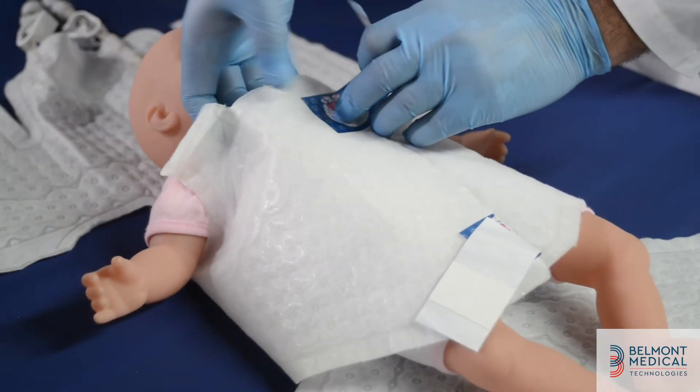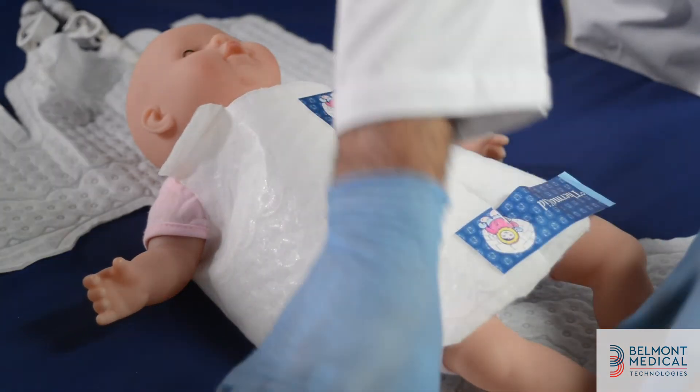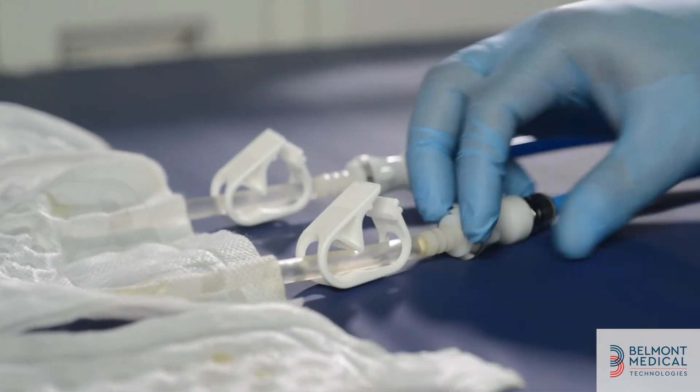Once the wrap is filled with water, secure the wrap on the patient. Make sure to leave one finger breadth between the wrap and the patient. Make sure the clamps are open so that water will circulate through the wrap throughout the treatment.